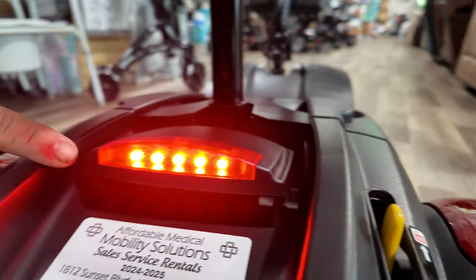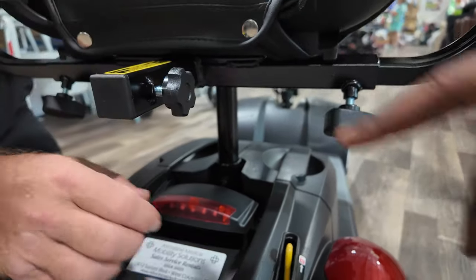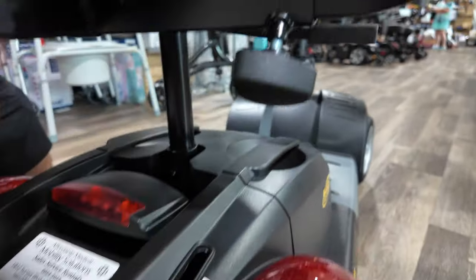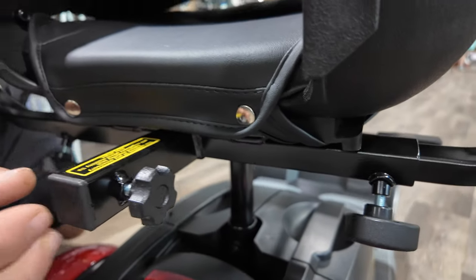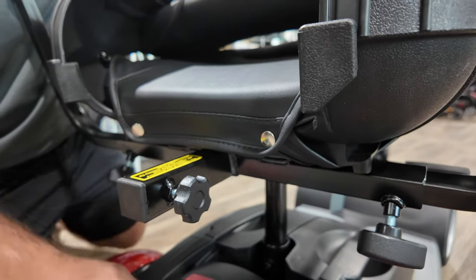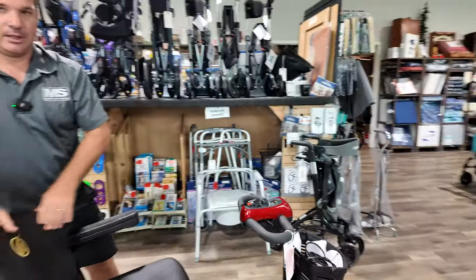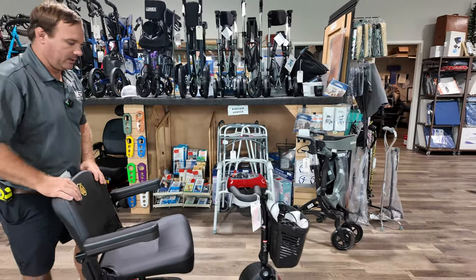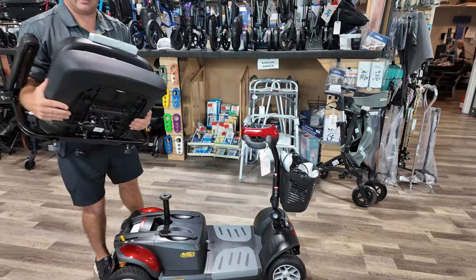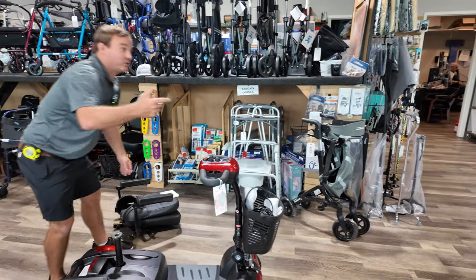That beeps because it was in free-wheel mode — all scooters are going to give you some type of indication of free-wheel. There's your light at the back too, so make sure this is in drive. You can adjust the arms by loosening this. There's also a receiver port here that holds an oxygen tank, a walker, a basket, or whatever you might need. It's a very dependable scooter, but it is a little heavy.